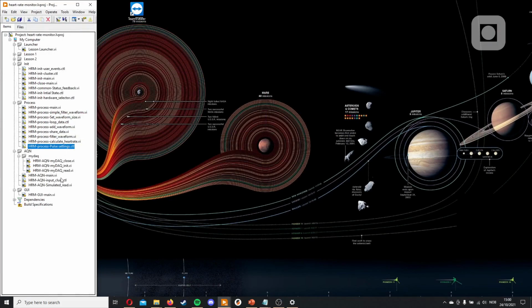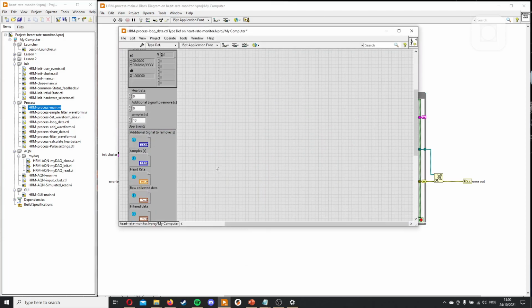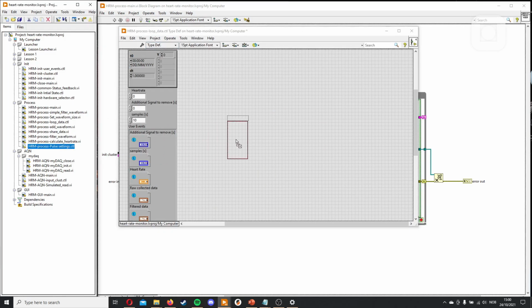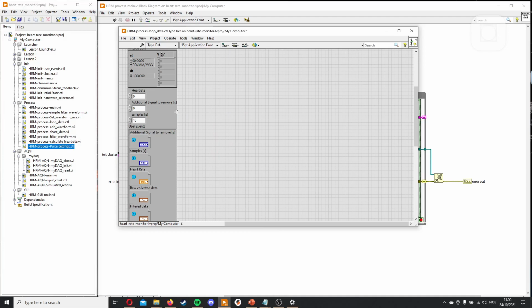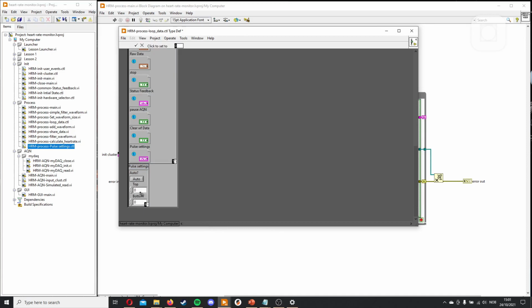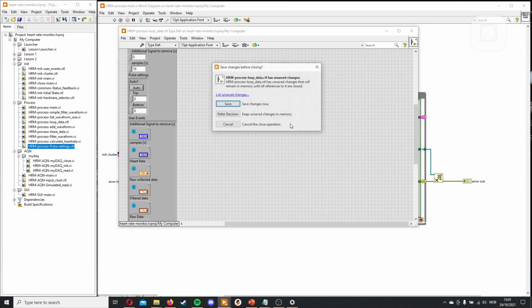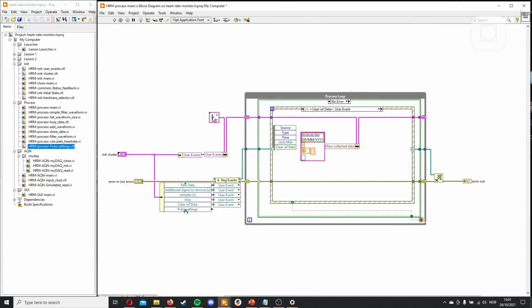Let's go to the processing. Here we need to make a receiver event that takes the input and then places it in here. We can add the data to our typedef so it can store it and send it around. I like to have the user events at the bottom, so I'll just put these and trade them. There you go. We need to add the pulse settings there and put them into the user event so it will show up here.